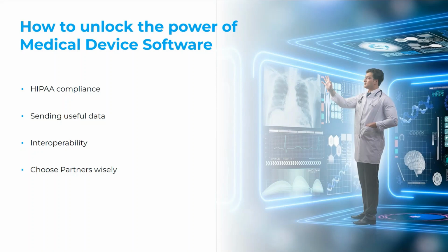And then sending useful data is a big one. This is something that I feel like a lot of these new kind of softwares and medical device companies aren't considering. Like, what data is going to be useful to the doctor or to the practice, the provider, the nurse, whoever's going to be looking at this data. I talked about this in a previous webinar as well, which is that sending your heart rate for the last month isn't going to tell me anything as your physician.